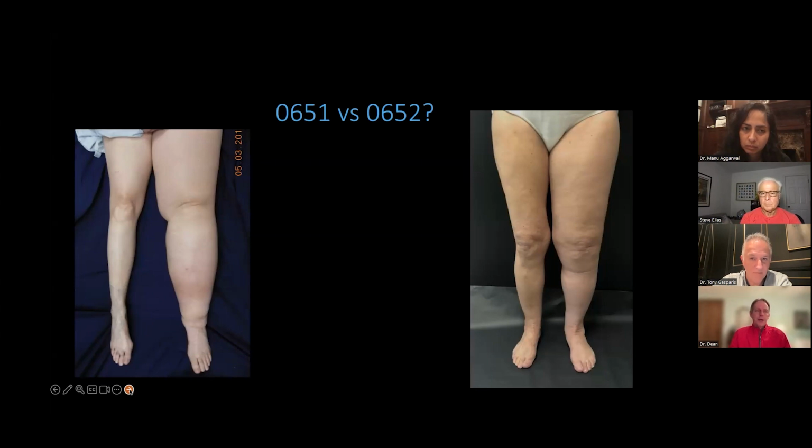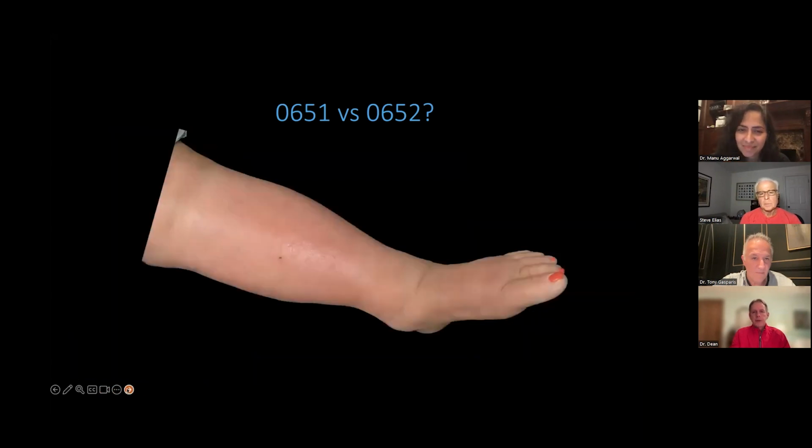And I would point out on that slide you showed, Steve, there are cases with insurance companies, if you initially document, I mean, you have to go through those documents, your 4 weeks of conservative therapy, elevation, exercise, or compression. But if you can show a unique characteristic, like these patients having pelvic lymphedema, a lot of times you can go directly to a 652. So the audience is on board. I like it. Must be a learned audience.